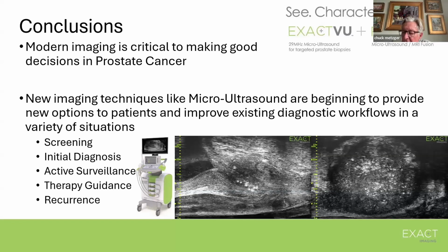How about if you use this micro-ultrasound for a testicular mass? Is it better for other types? We used it to see the prostate volume, post-void residuals, and what the testicles were doing if they had some. And is it good for that too? It probably is. The testicles are a particularly interesting example because the seminiferous tubules are not that different in size from the prostate ducts. They're actually quite similar. So we think it's going to work very well. There's a researcher who was at Hopkins and actually just moved down to, I think it's Baylor in Texas, who's been looking at this for a couple of years and has some very promising results that he presented at the AUA just a couple months ago.